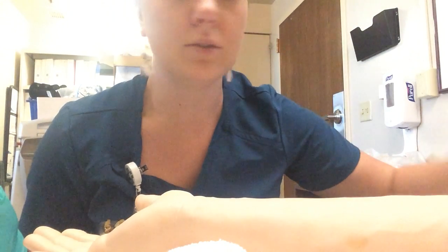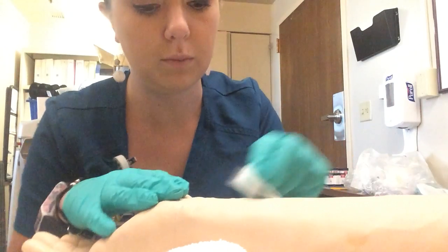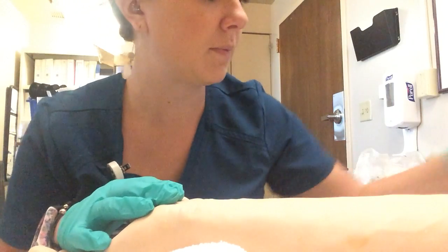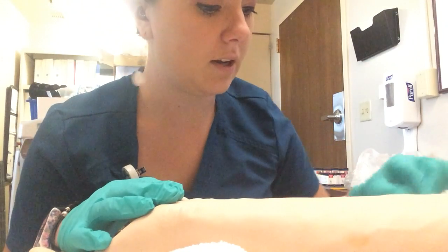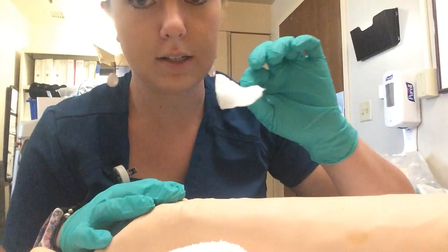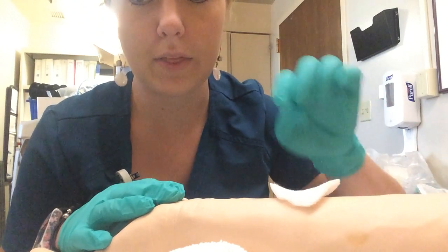The next thing I do is open up my package of alcohol and clean off the skin really well. Then I opened up my gauze pack and got a little piece of gauze. I'm going to set that right there for afterwards.